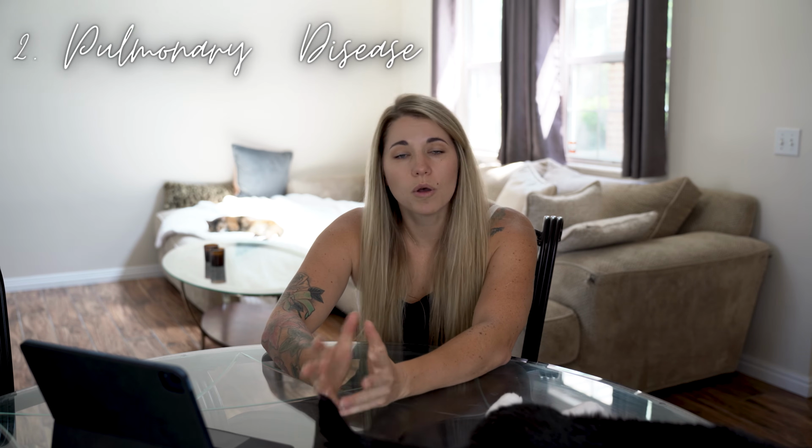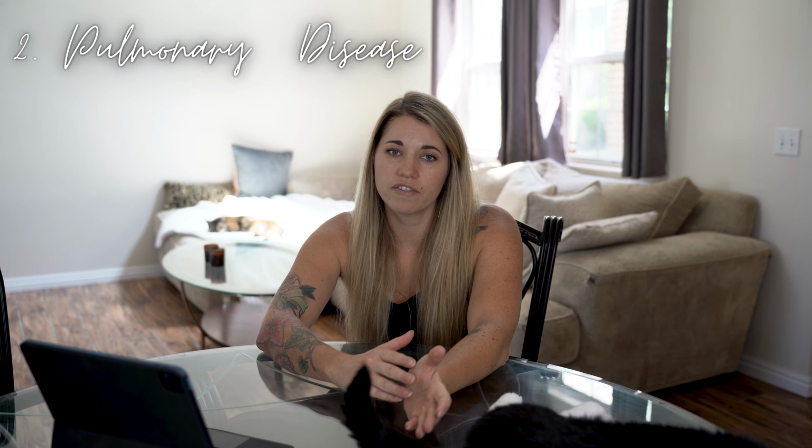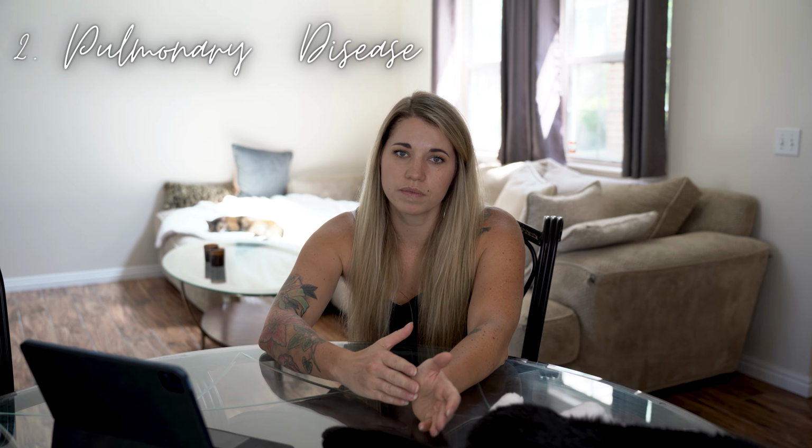Patients with severe pulmonary disease may also benefit from positive pressure ventilation. So patients that are maybe able to breathe on their own but not able to adequately ventilate themselves may require that extra positive pressure to adequately force air into their alveoli. Obviously, we would usually try to avoid anesthesia in patients that are not able to well ventilate themselves, but there are circumstances in which you may not be able to avoid anesthetizing your patient.